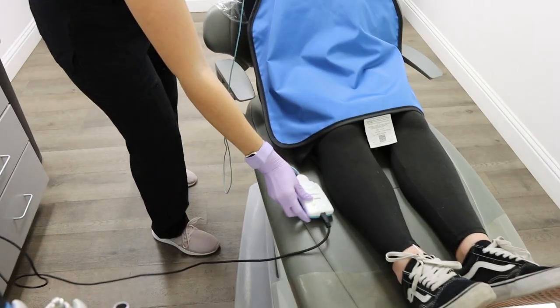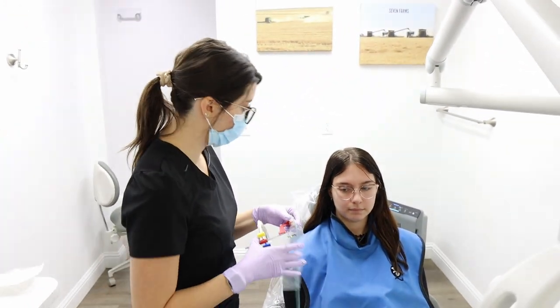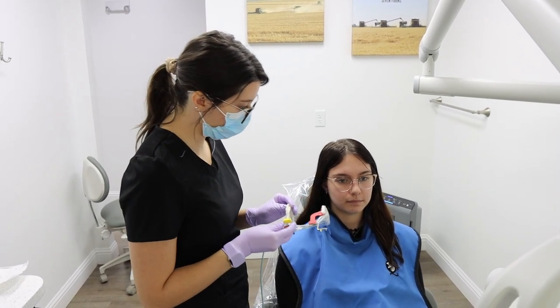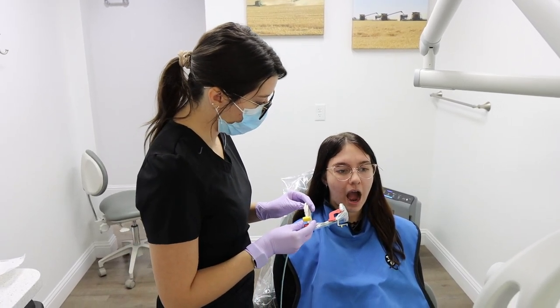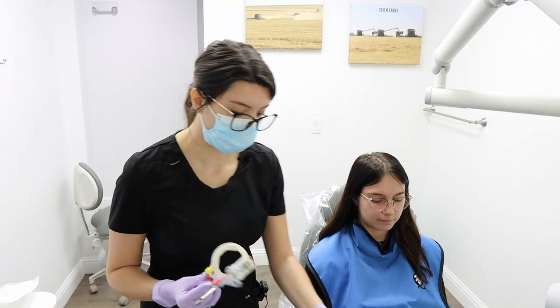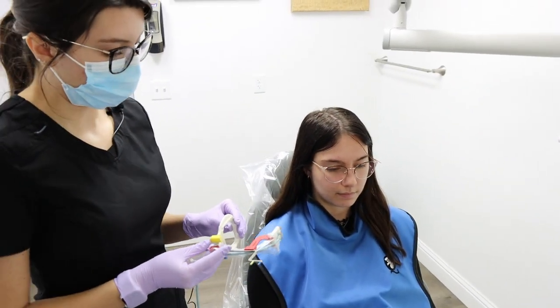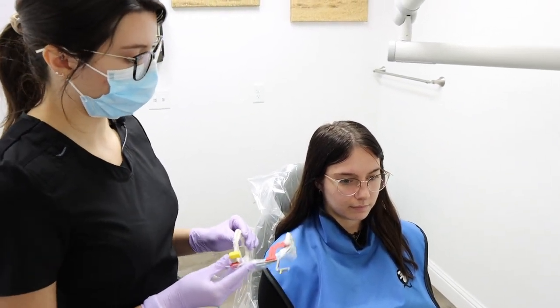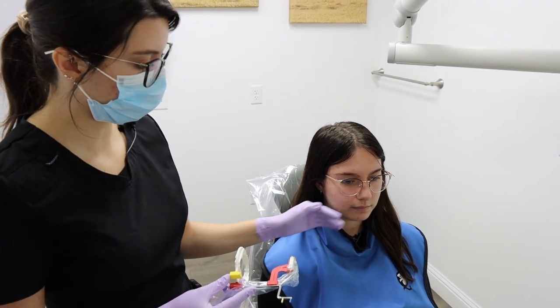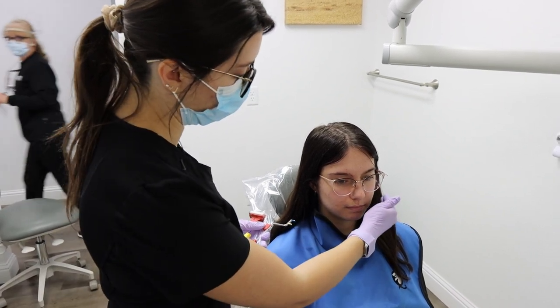You're going to set the sensor hub on the chair, and we're now going to begin taking the bite wings. You're going to start off by taking the molars. You're going to place the hub on the patient chair so it doesn't fall. When we start taking bite wings, you're always going to start on the right, starting with the molars and pre-molars, and on the left side you'll go pre-molars and back to molars.